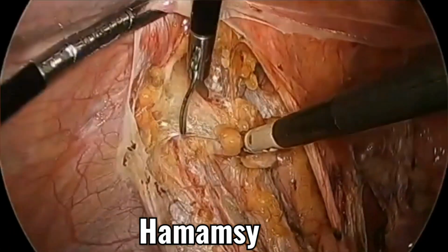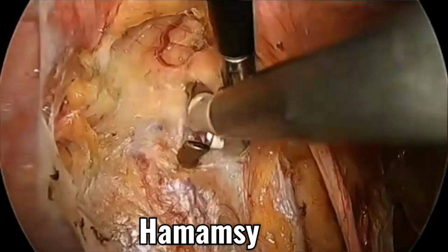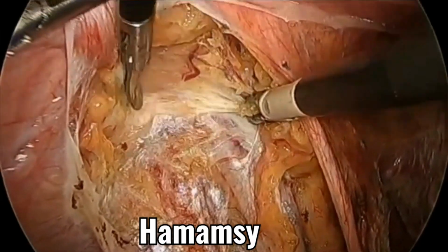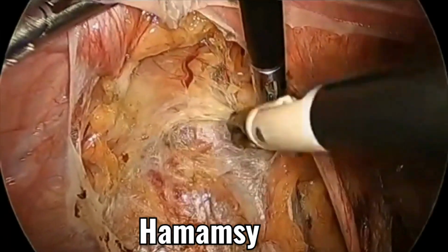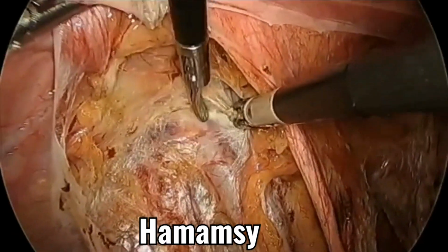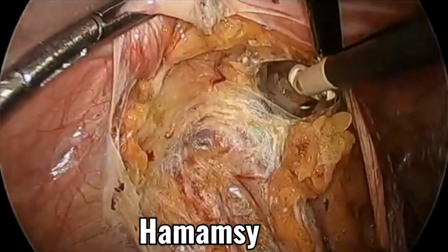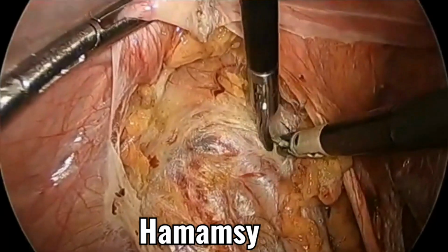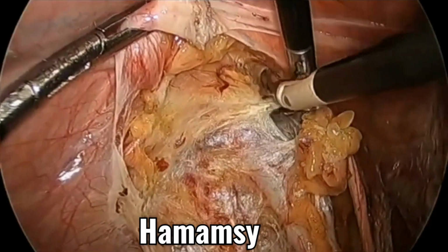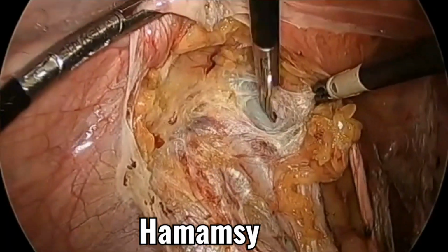Removal of the lymph node. خلاص removal of the lymph node يا جماعة الخير لازم retrieval of the lymph nodes. لازم النودز are placed in the endobag and extracted via a port site. تمام اهو.